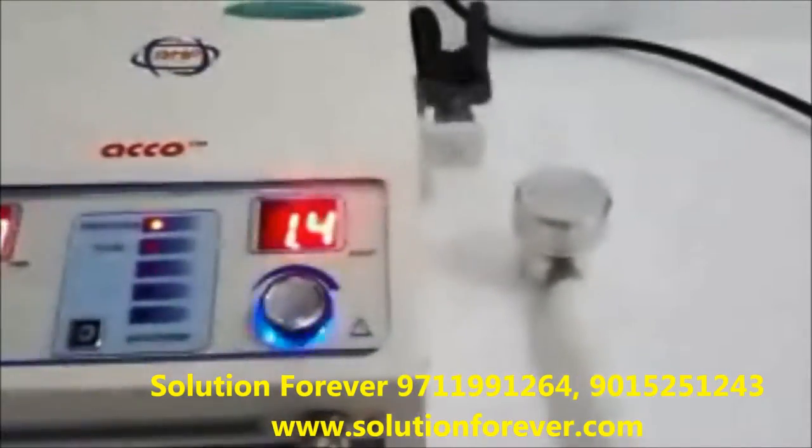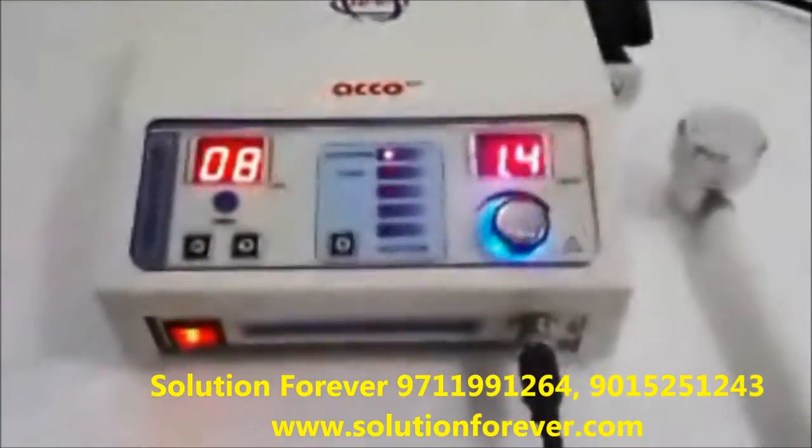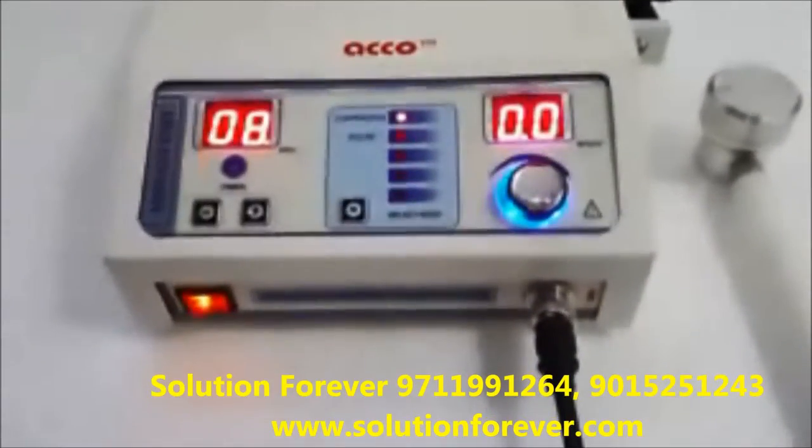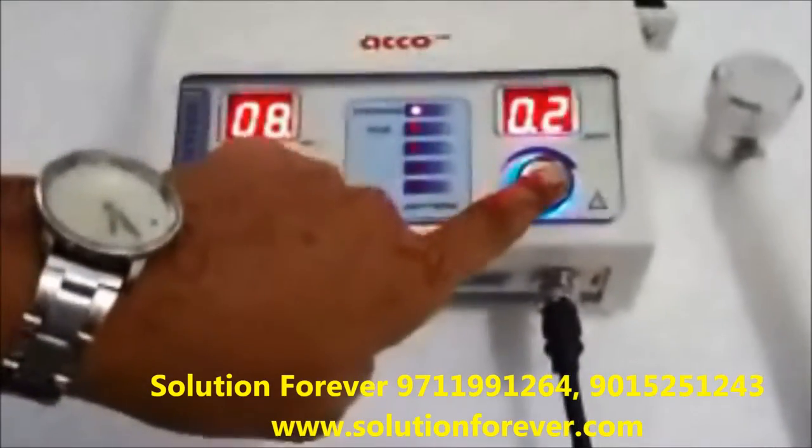This machine has a special feature to pause the treatment in between. To pause the treatment, press this knob. To resume again with the same setting, press the knob again.